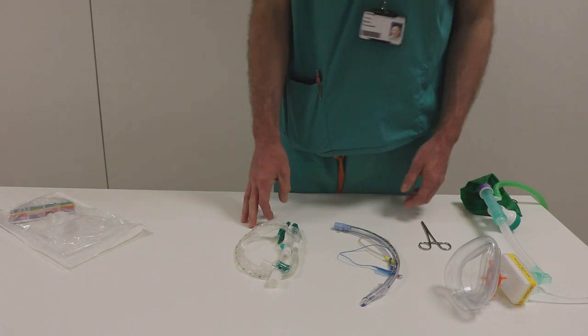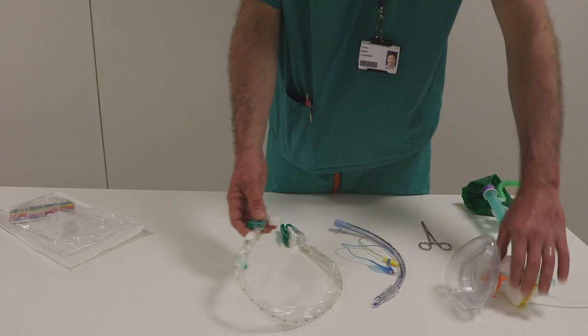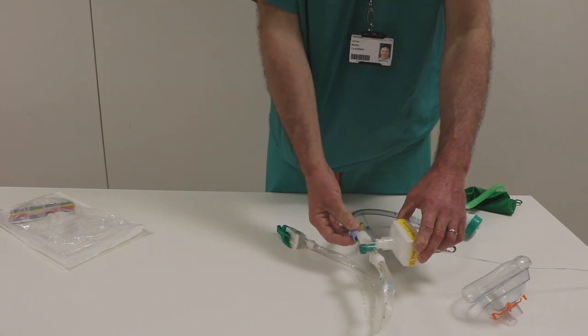What we find is the optimal setup is that we connect this, once the patient is intubated, to the other side of the viral filter like this, and then the tube will be connected like this.